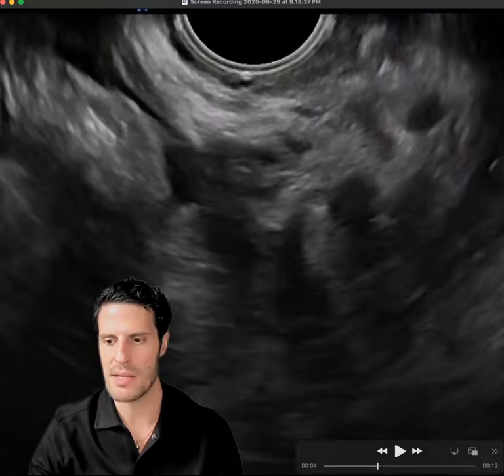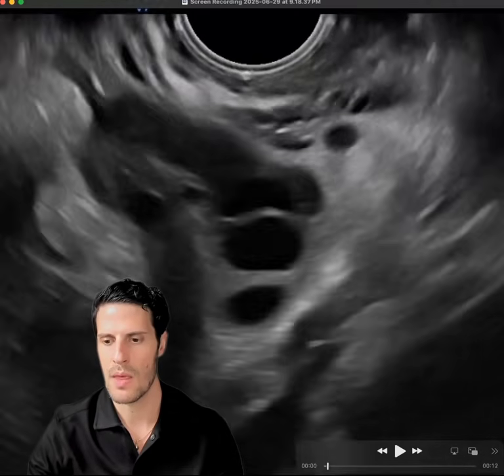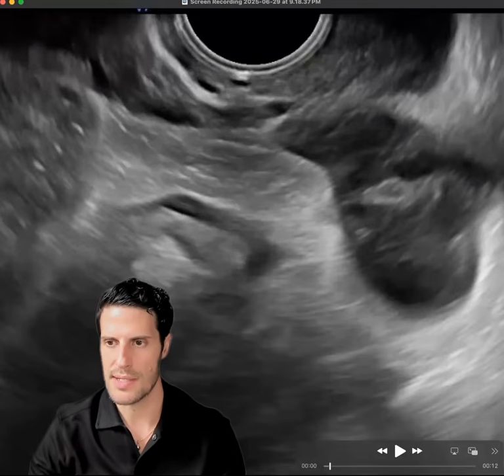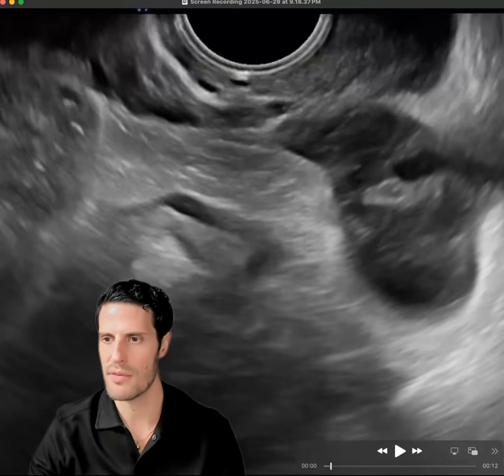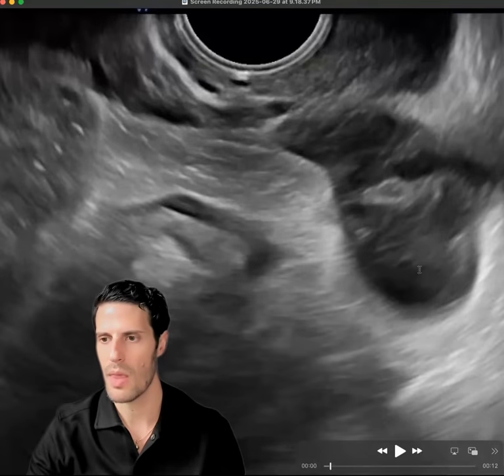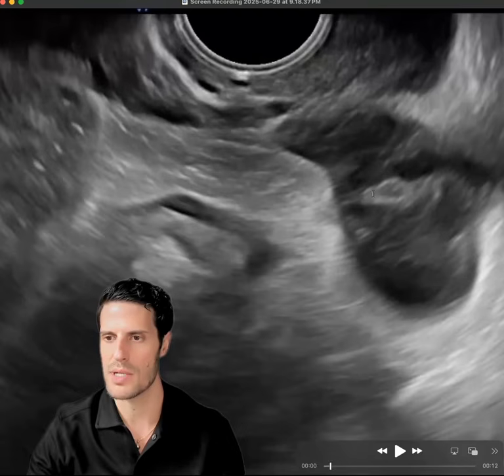All right, so I've played it through two times. I'm going to go back to the beginning, which is around here. There we go. And I'm going to tell you the first thing that I see. So here's the beginning of the clip. And the first thing I see is this area of mixed echogenicity. And it's got some low-level echoes, it's got some hyperechoic areas, some mixed echogenicity.